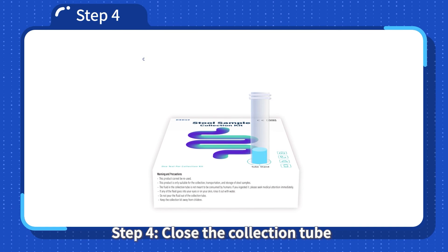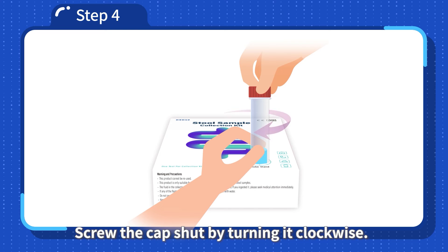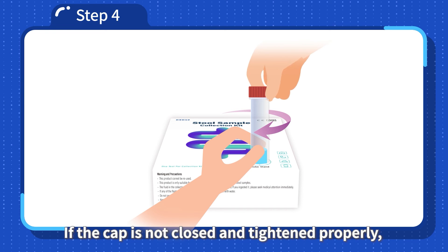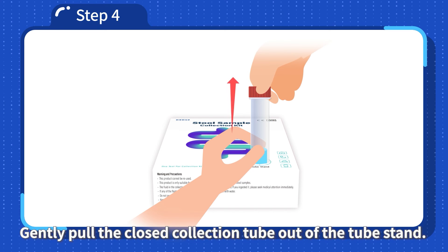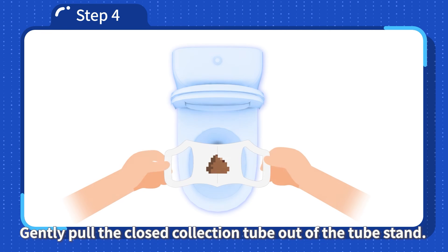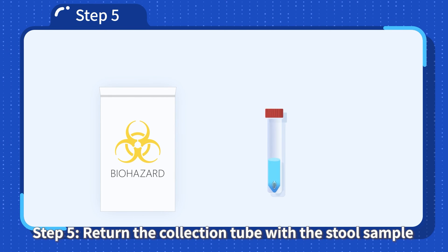Step 4: Close the collection tube by screwing the cap shut, turning it clockwise. If the cap is not closed and tightened properly, the liquid could leak out of the tube. Gently pull the closed collection tube out of the tube stand. Flush the toilet along with the flushable sample collection paper.